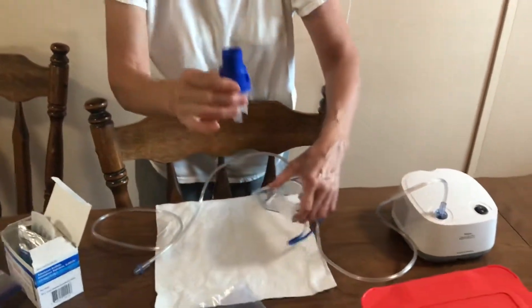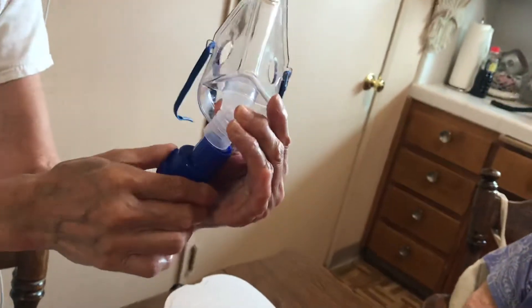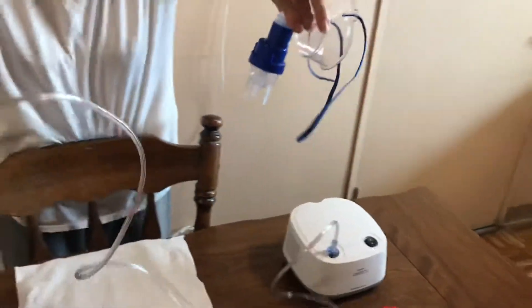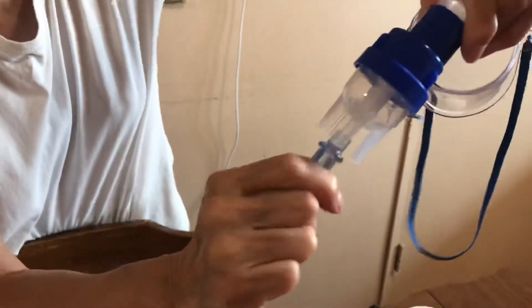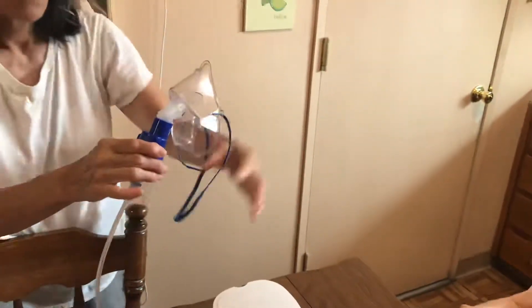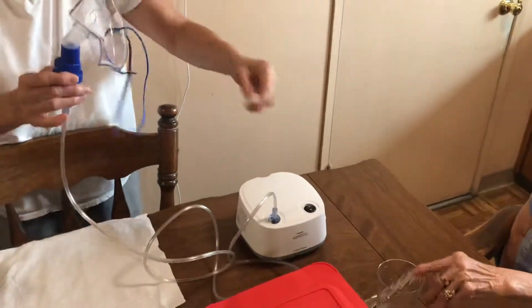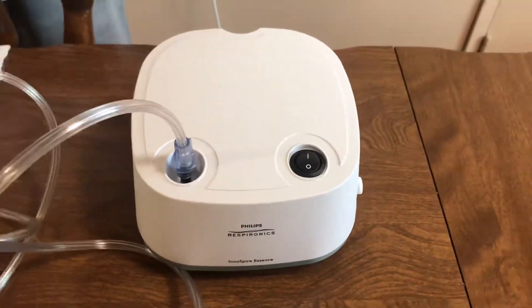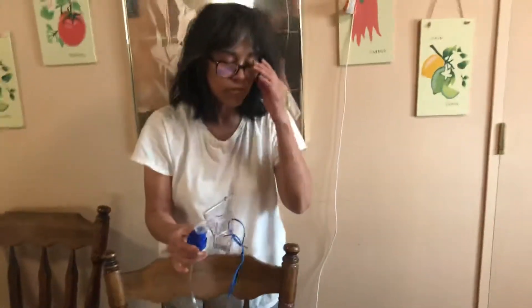This part goes on the bottom of the mask, and then the tube goes on the bottom like this. Then you give it to mom. You press that button to fire it up. She has this on her face and then the machine starts — she's on it for about 20 minutes.